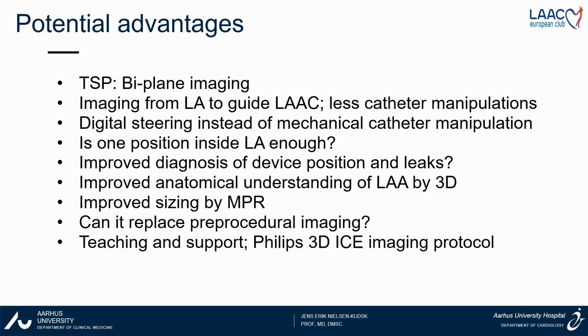So for me, the transseptal puncture will be easier with 3D ICE. Without manipulating the probe, you can get longitudinal and cross-sectional views.